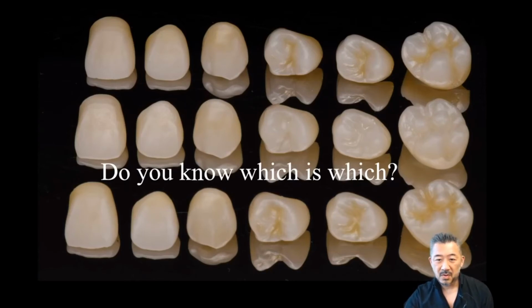So, you know what I want to say? Well, in my impression, the top and the bottom colors are almost the same. See? What can be said from this? The zirconia painted with only O1 and O2 on the TT multilayer disc is the easiest and has a good color tone.